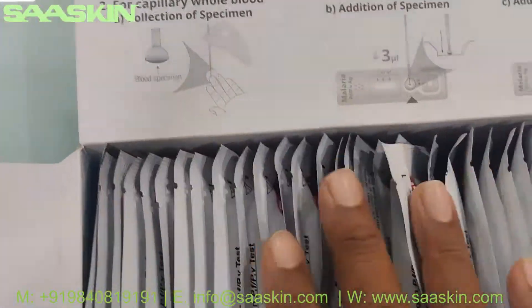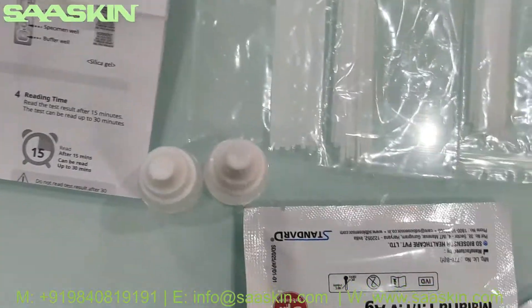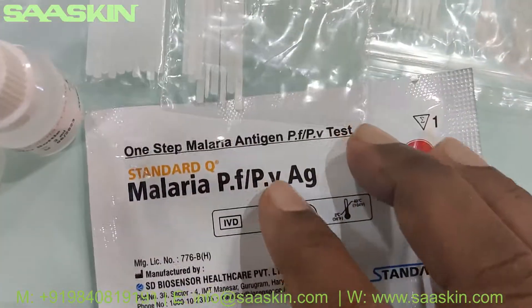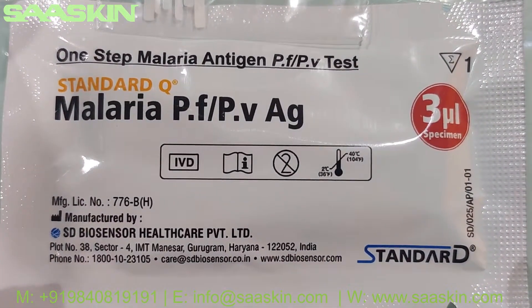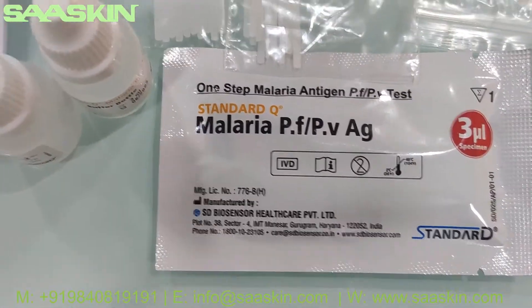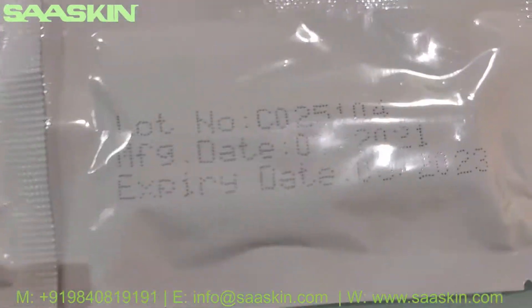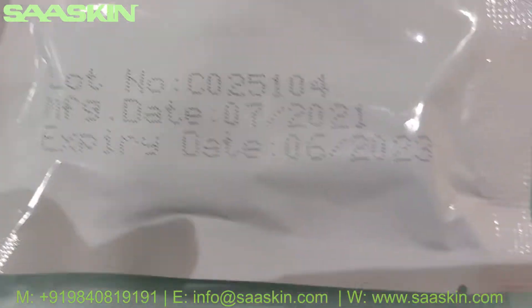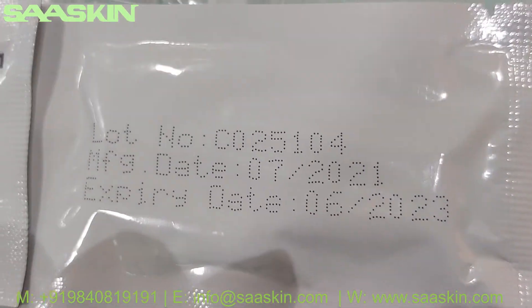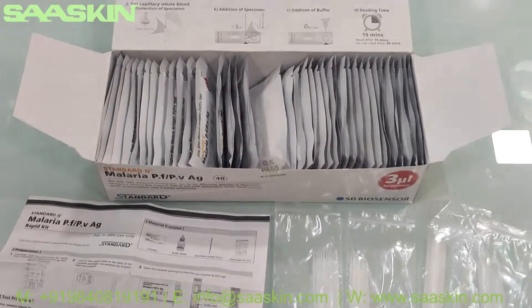You can see the 40 test cassettes in this box. Let me take two cassettes to show you. This is how the cassettes look like in detail. On the other side of the cassette, you can see it has an expiry of two years. So this is the total kit content.